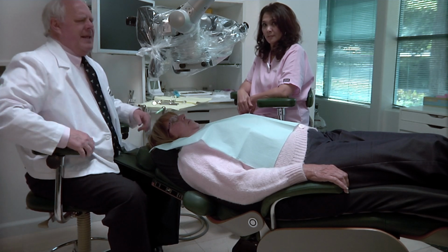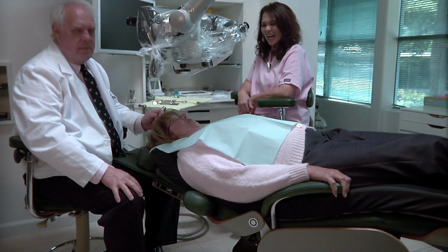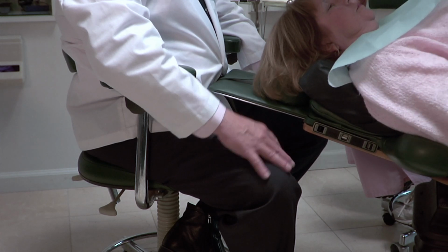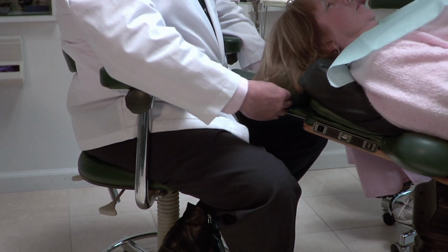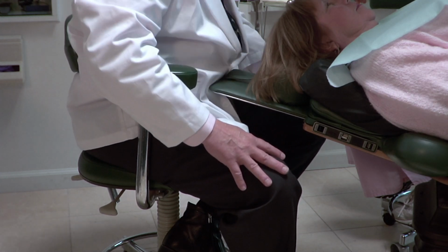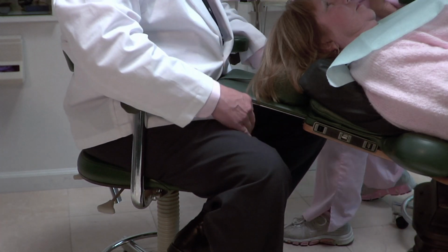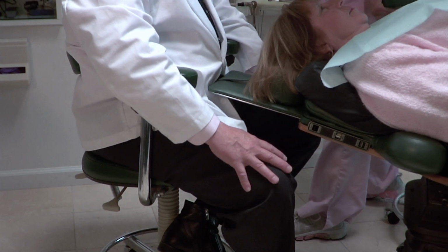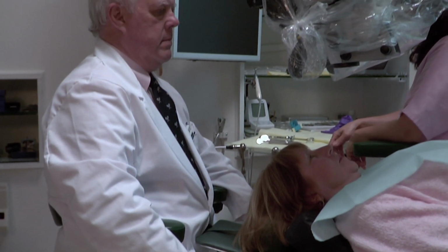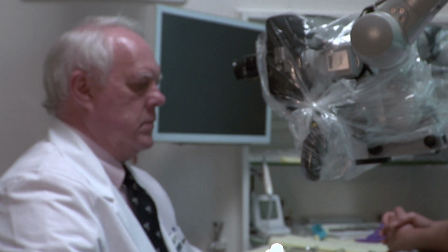So many times the head is not really at the foot of, or at the head of the chair. It's recessed, and then because the headrest is sticking out, the doctor has to lean forward, and this gets to be very, very stressful on the lower back and even the shoulders. So that extra distance makes a huge difference. You're far better off removing the headrest and making it so the patient's head is always right underneath your head, right into your belly actually.